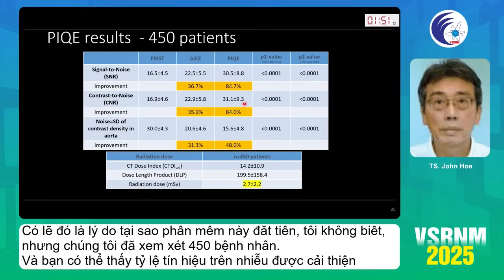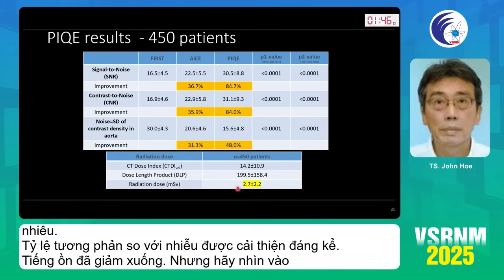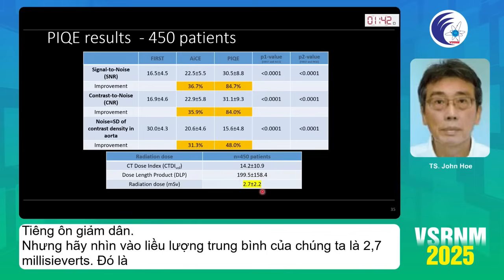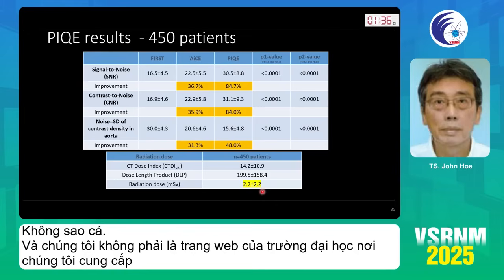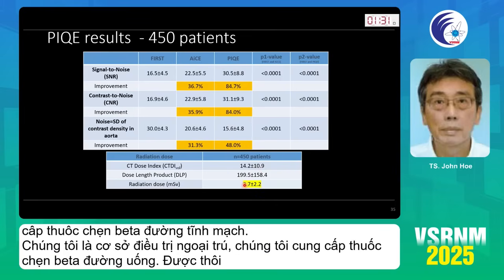The contrast to noise ratio improved a lot. The noise dropped, but look at our average dose, 2.7 millisieverts, that's all, okay? And we are not a university site where we give IV beta blocker. We are an outpatient site, we give oral beta blocker, okay? So this is very good. It's very easy for us to do.